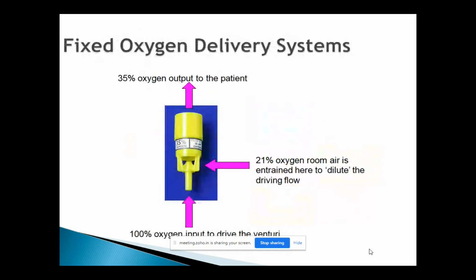To make it very clear, I'll give you an example here. You can see it's a fixed oxygen delivery system. On the body of the valve, it says 35% oxygen. On the side, it tells you that you need to give 10 liters of oxygen. So the question is, whatever oxygen we are giving, whether it is 1 liter or 2 liters or 3 liters or 10 liters, it's 100% oxygen, right? Because the percentage of oxygen coming from the flow meter is 100%. Only the flow is different, 1 liter to 15 liters.